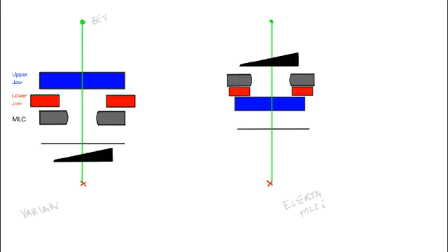There are other solutions as well to get a wedged profile in a beam. You can have the dynamic wedge, in which case a jaw is swept across the field. And if the dynamics of that are done just right, then you can build up dose in a profile that looks like a wedge profile. And again, you can change the angle as needed. So there are different solutions.